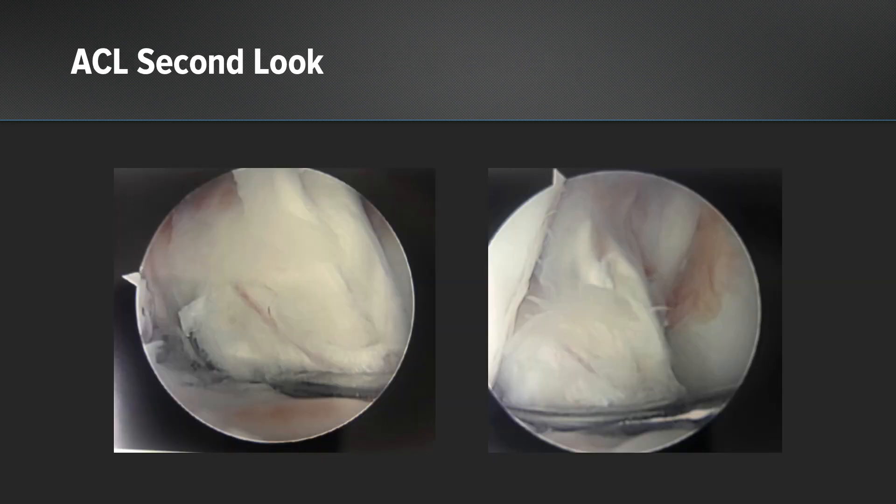Here is a second look at a biologic ACL reconstruction at the six-week time mark, and you can see a vessel fully identified from the femur to the tibia on the ACL graft.